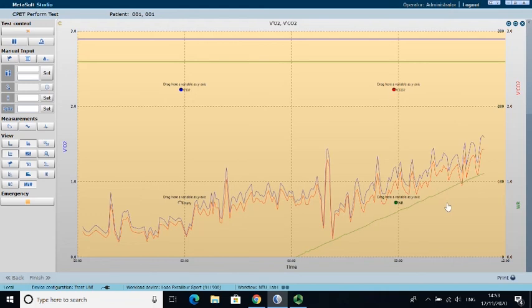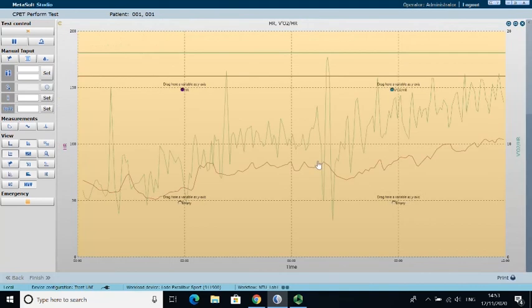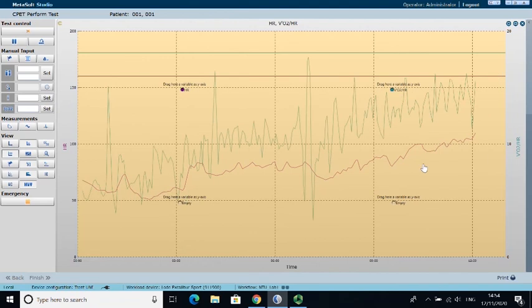So this is the linear relationship between increasing work rate in green, increasing oxygen consumption in blue, and an increase in CO2 output in red. And so the order is this: we need to do more work rate in green, we need more ATP, which we don't measure. In order to get more ATP, we need to resynthesize it using more oxygen, which is the blue. Because aerobic respiration converts oxygen to CO2, we also increase CO2 in a fairly linear fashion as well. And then because we're increasing CO2, what we're going to see in a minute is that it's going to drive our ventilation up.